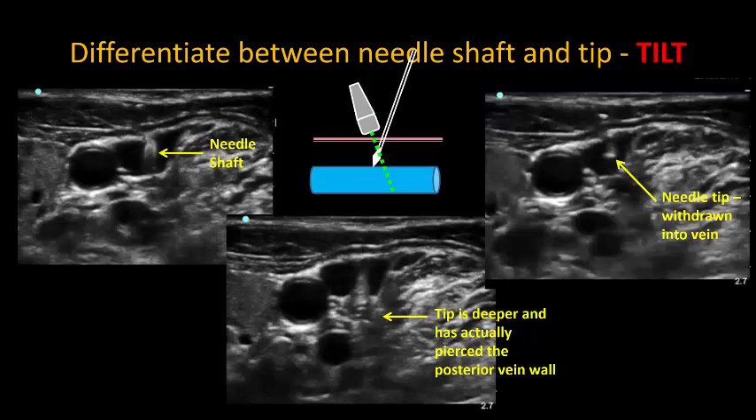However, it can sometimes be tricky to slide the probe, especially if the clavicle is in the way. So, an alternative is to tilt the probe and fan the beam to track the needle as it advances. Unlike with nerves, this tilting of the probe does not change the visibility of our target, which is the vein. And so, I would recommend this over sliding for out-of-plane vascular access, as it's more intuitive for less experienced operators.